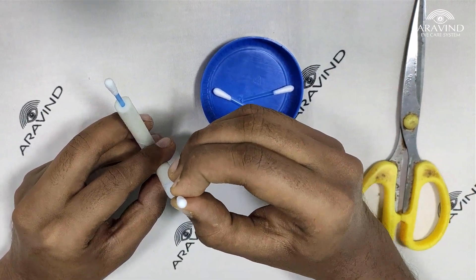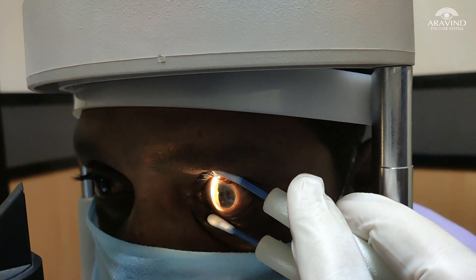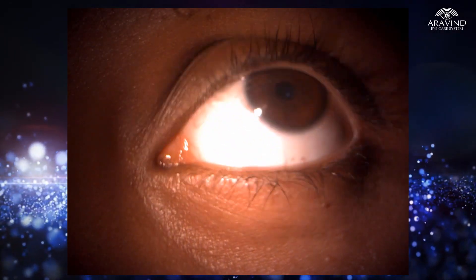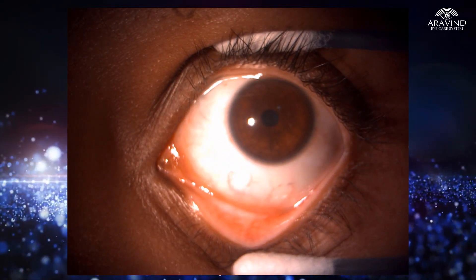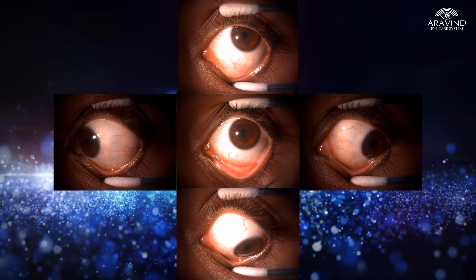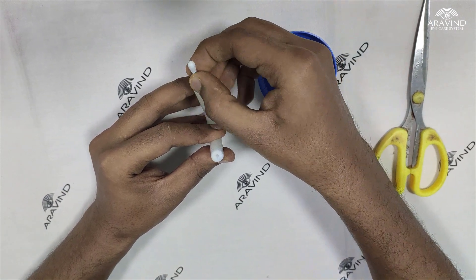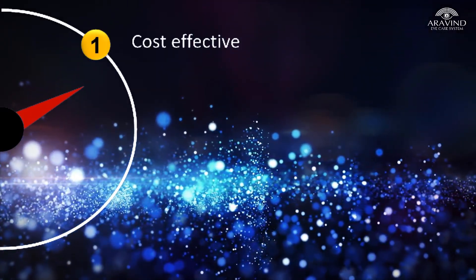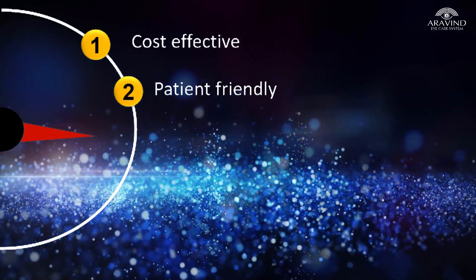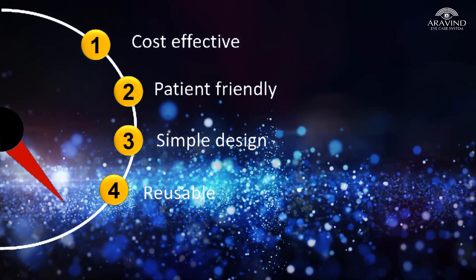Due to its recoil memory, the prongs recoil back to their original position when released. The device does not require use of topical anaesthetics like proparacaine during examination, as it touches only the skin of the eyelids, making it comfortable for the patient. After examination, the buds are disposed. For successive examinations, every time a new bud is used, making it cost effective, patient friendly, easy to use, reusable, and safe during the COVID-19 pandemic. Thank you.